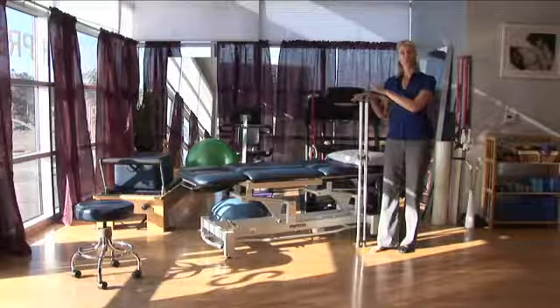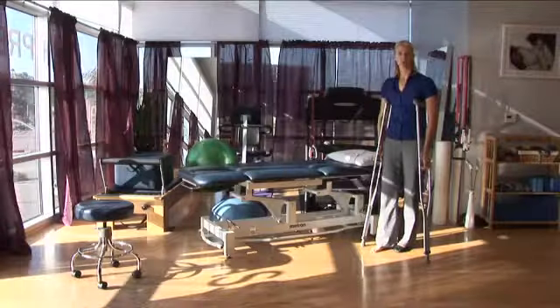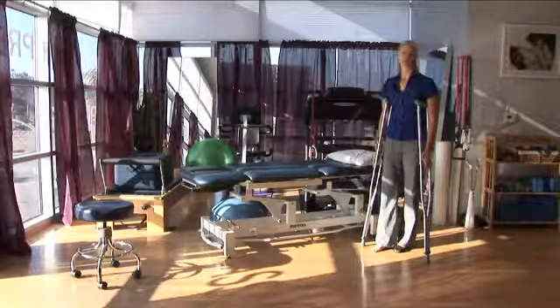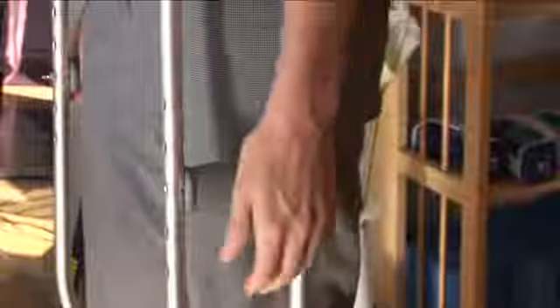So you want to use two axillary crutches. You put them on either side of you and make sure that they're fitted appropriately. A physical therapist can help you fit the crutches appropriately so that you don't strain anything in your arm or in your wrist.